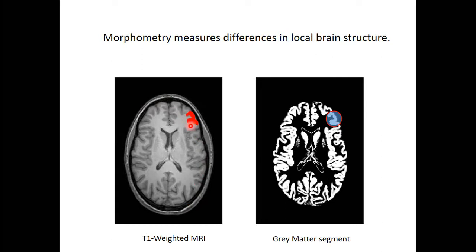You can make a manual segmentation. Segmentation means a separation of the gray matter. However, it can be biased. It's always subjective, though it is still a gold standard for measurement of alterations of brain structure. But an objective measure is to make an automatic gray matter segmentation, and it is very hard.